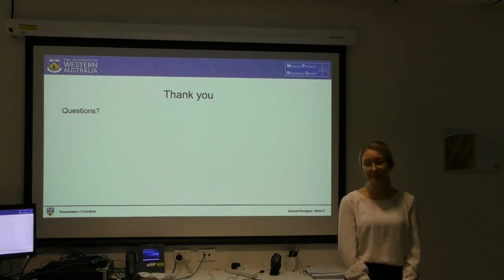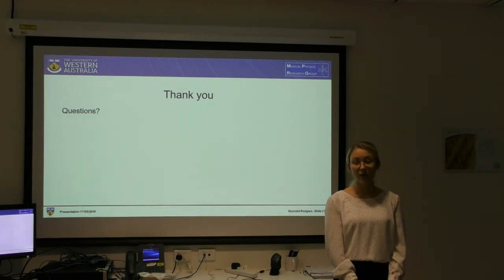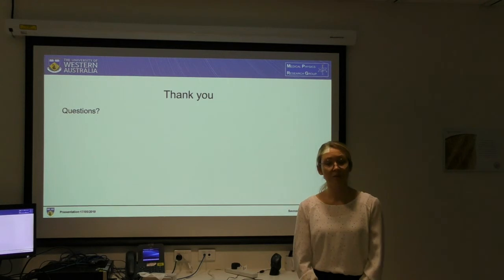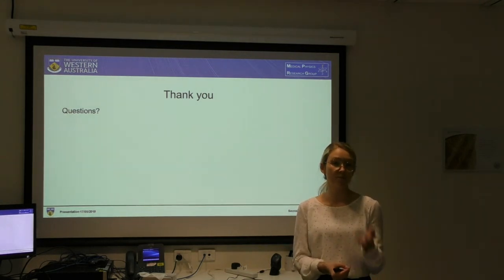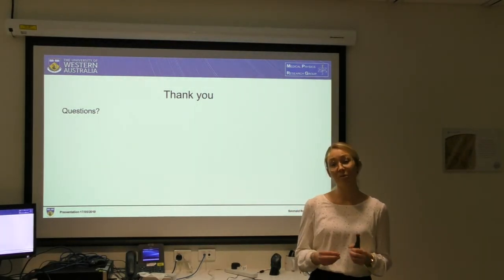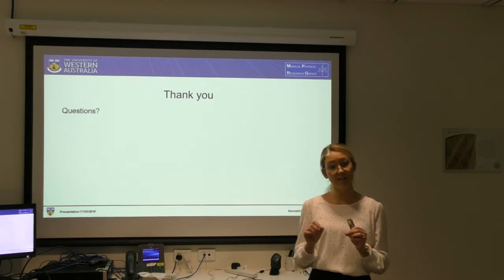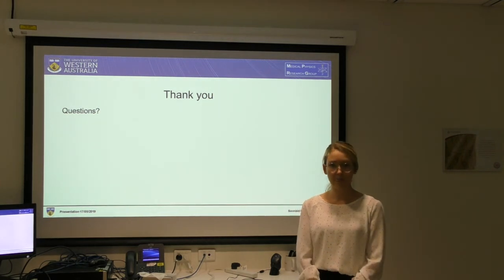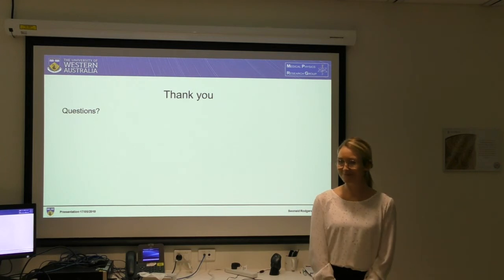Yeah, definitely. So in terms of dosimetry, what type of dosimeters? At MTP we have a CT dose profiler. So we've got a pencil-shaped ionisation chamber, which can do simple dose measurements. But the CT dose profiler is capable of doing the CTDIvol in one measurement rather than the 5 measurements, which is the standard method outlined in the AAPM Task Group 204.